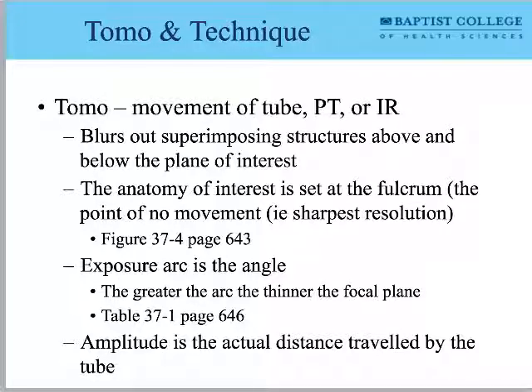What I'm talking about here is a simple machine where this part is going to move a whole lot up and down, just like a seesaw. This part will move a lot up and down. This part doesn't, right? Just like a seesaw at the playground, now I'm going to set the seesaw on the kidney. That's the part that I don't want to move. Everything else is going to go up and down. What I'm going to wind up with is a picture of just the kidney.